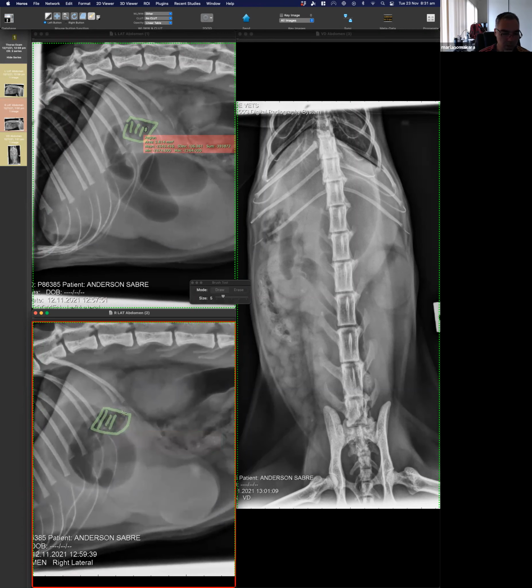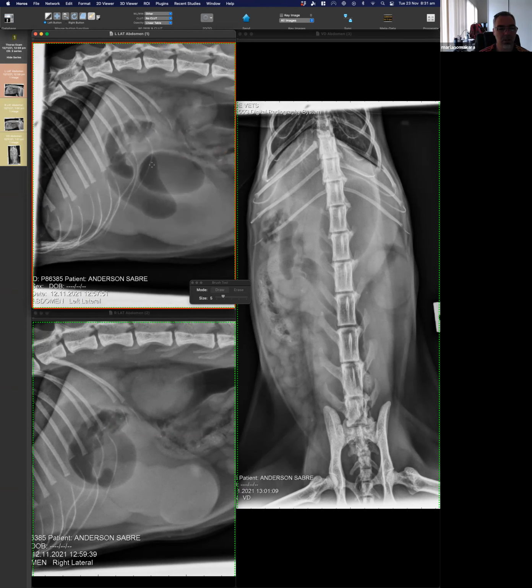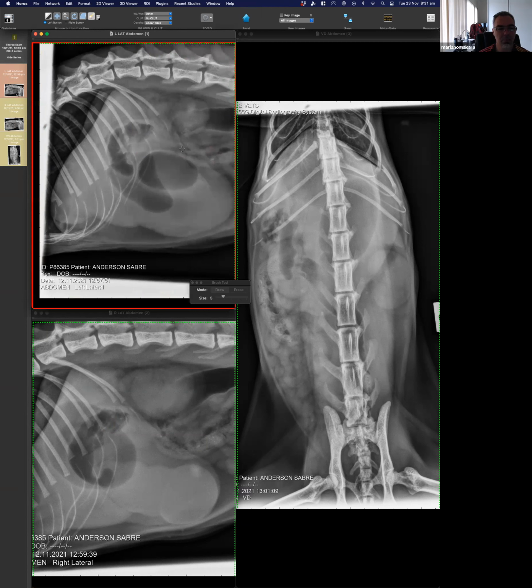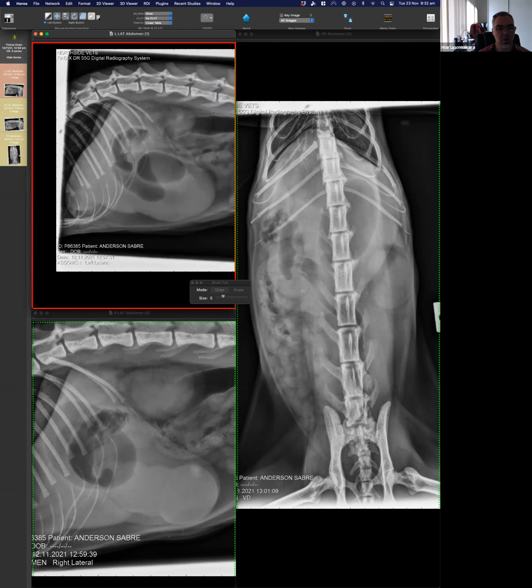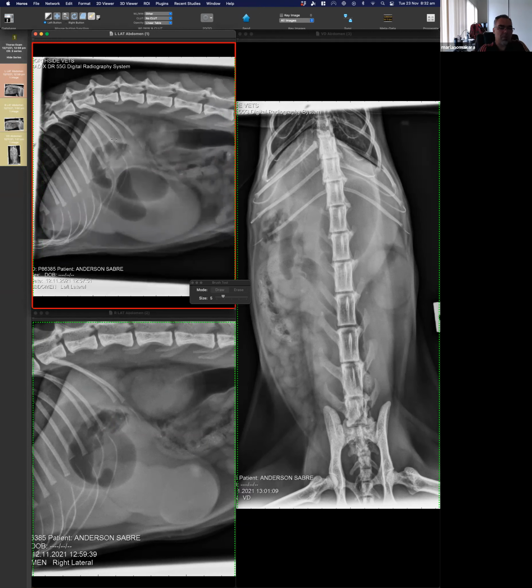Yeah, and that comes with time, and sometimes we make errors because we are confident. So the association between the history of this cat playing with a foreign body and then disappearance, and then the distension of the stomach and the very empty small bowel. For me, it was enough to say, I'm almost certain there is a foreign body there. Everything fits. And then, so I give you the answer.